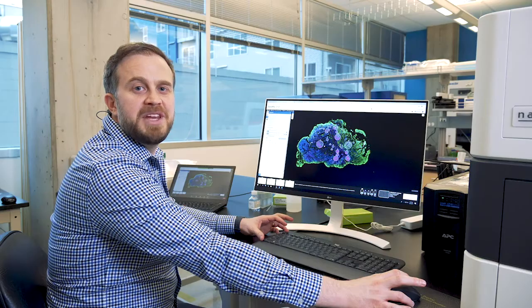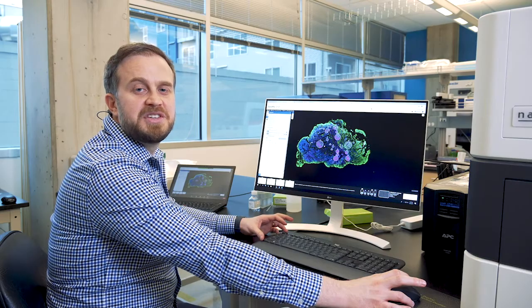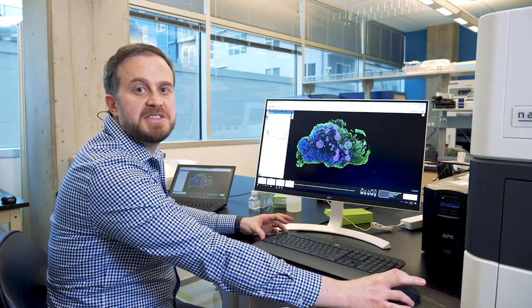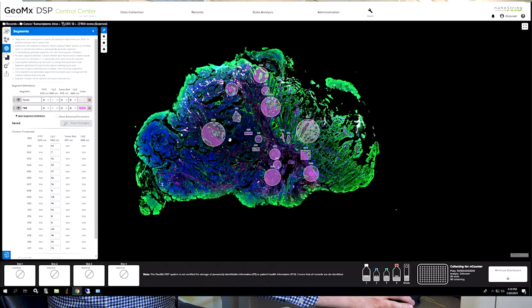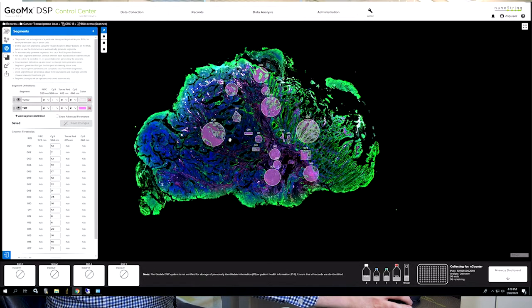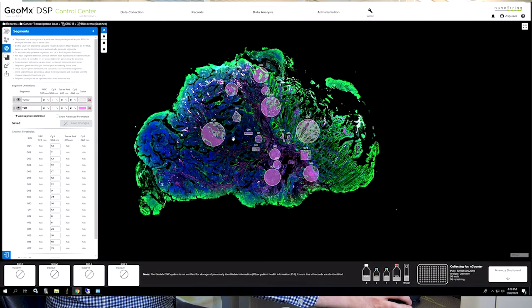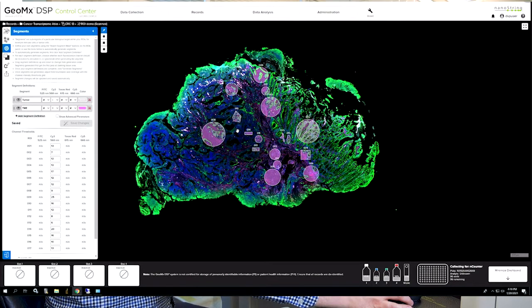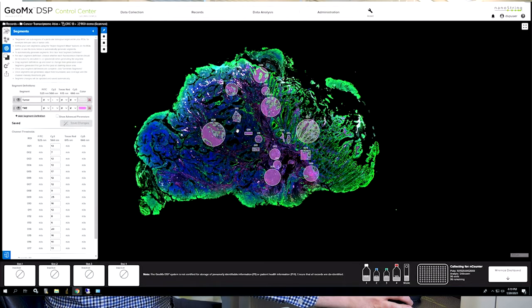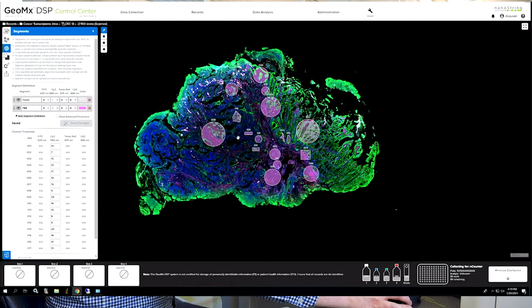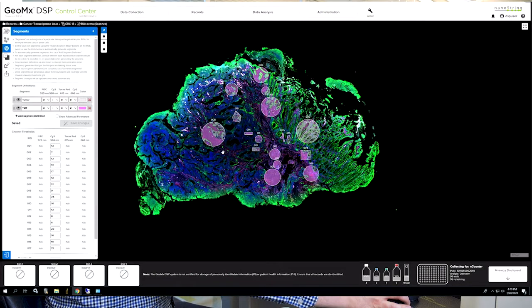Users can also create rules for segmenting the ROIs. This would let morphology of the tissue determine the boundaries of the area of illuminations or AOIs to enable 100% cellularity. For example, users can create tumor and TME segments across a tissue sample as shown on this example.